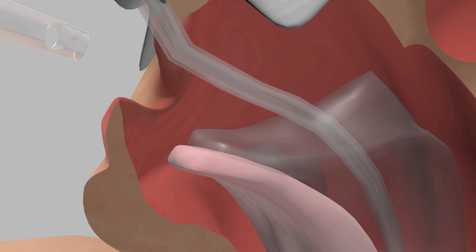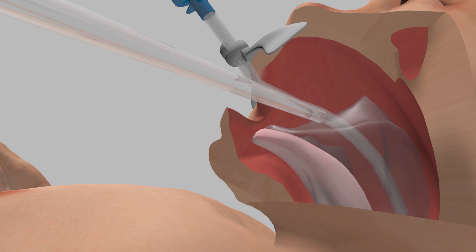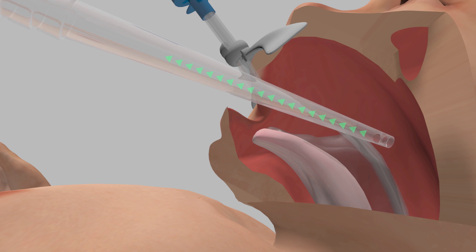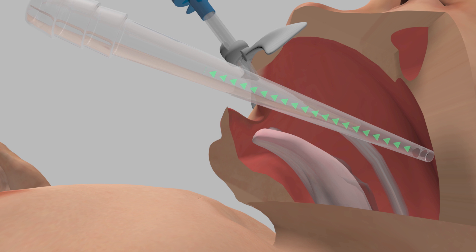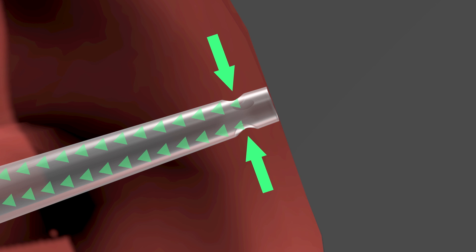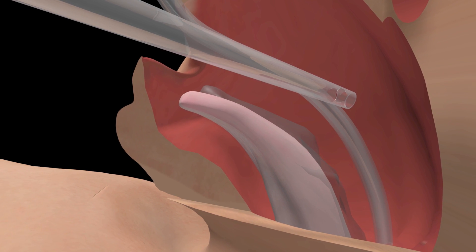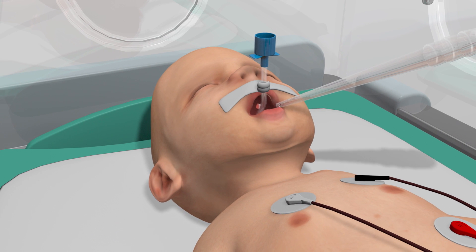But with the BB Yonkers 3-hole system, when the device enters the mouth it doesn't begin suctioning until it makes contact with the secretions. All holes quickly and safely suction without trauma. And should the tip accidentally touch the throat? Although the hole at the end is occluded, it does not pull or tear apart tissue, leaving the baby much happier and healthier.